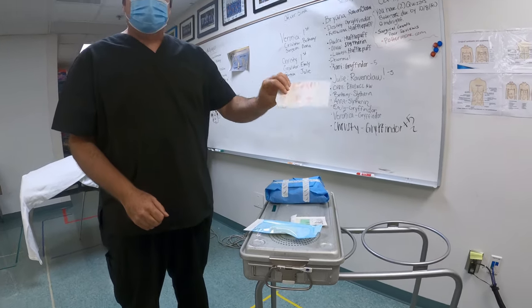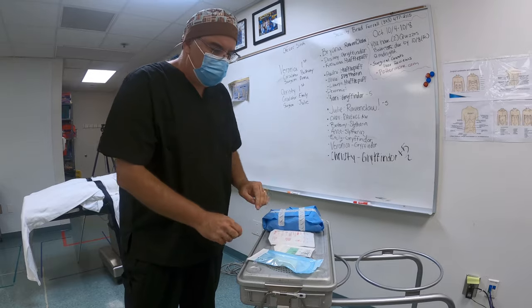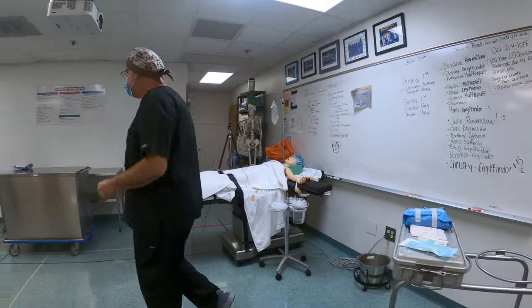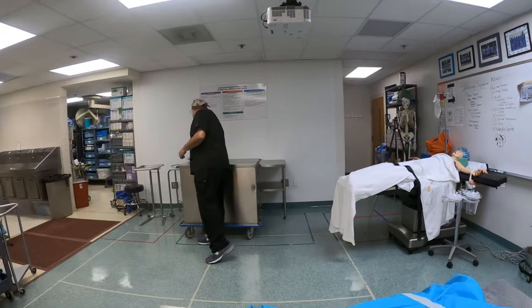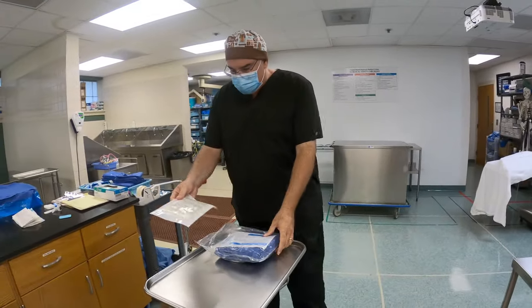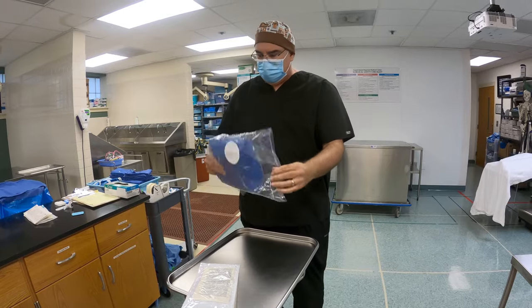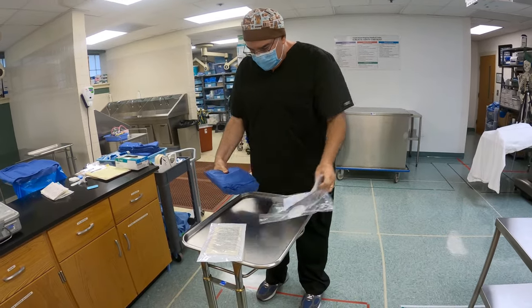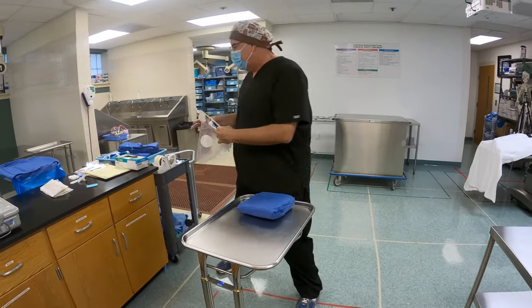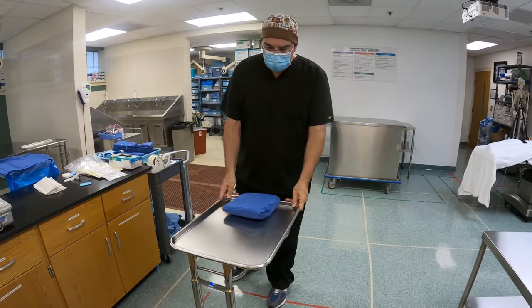I've got a pack of towels, I've got my second pair of gloves, and I've got a couple of peel packs — you're going to need at least two of these in order to open. And then finally over here I've got my gown. I can open this up, check for integrity — everything's good. Set the gown there. I've got my pack of gloves, which I'll set over here.